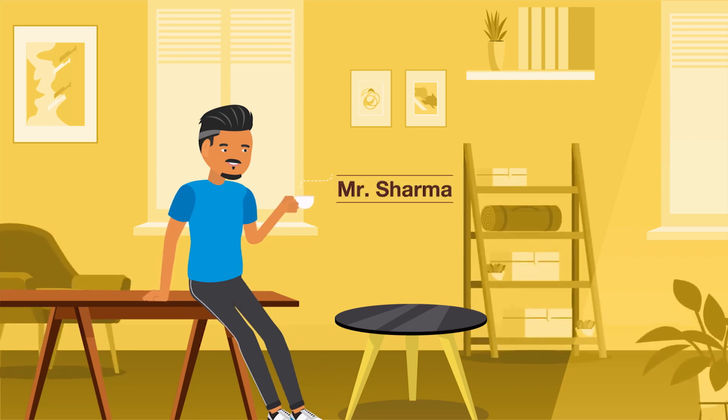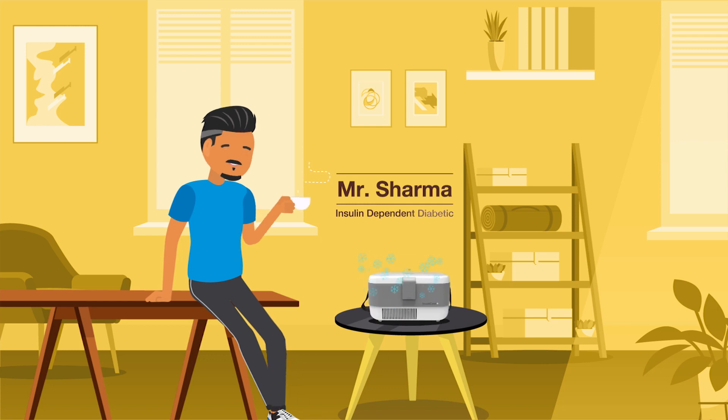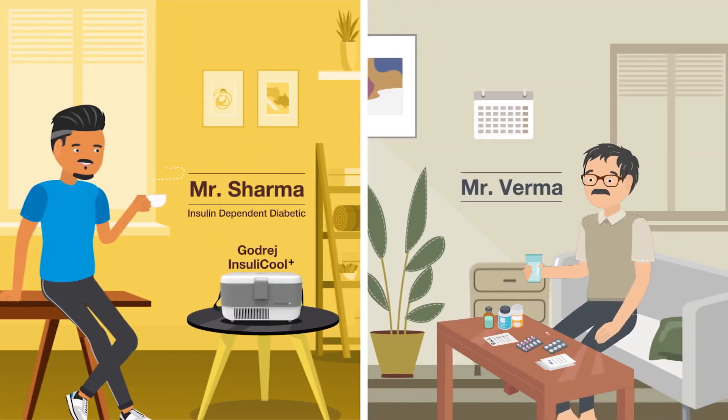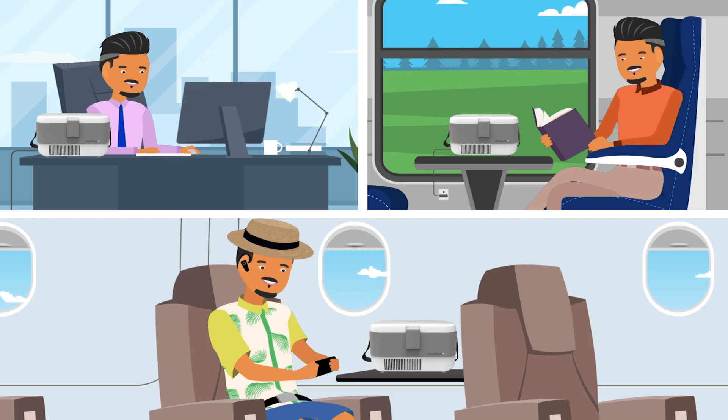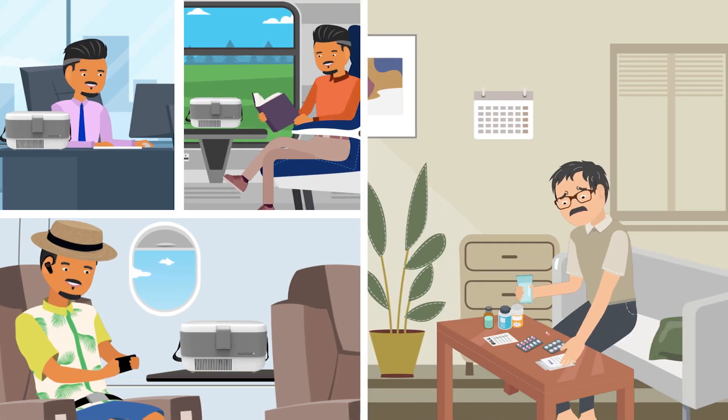This is Mr. Sharma. He has diabetes and for his insulin he got himself a Godrej Insulikool Plus. But Mr. Varma didn't. Mr. Sharma works hard and plays hard while Mr. Varma spends his time worrying.